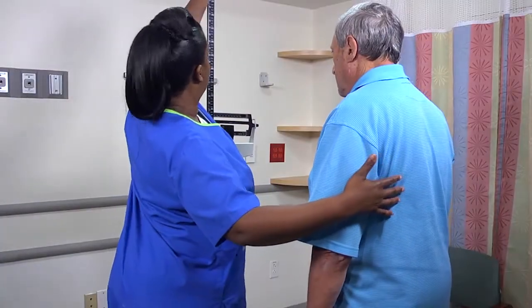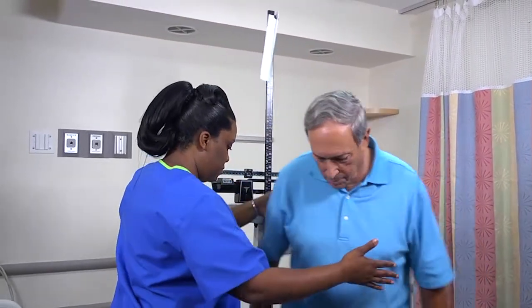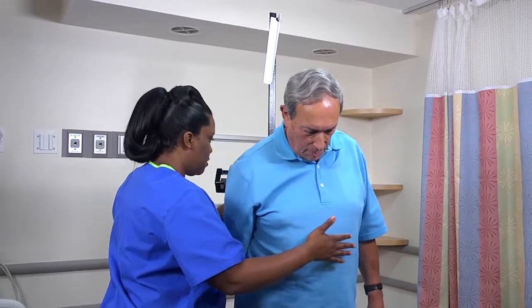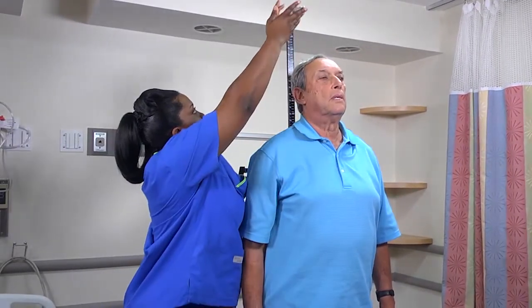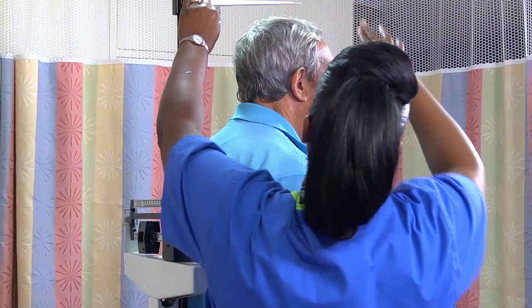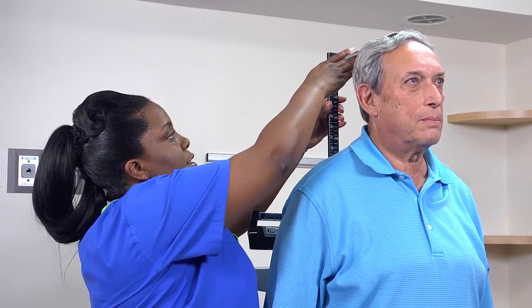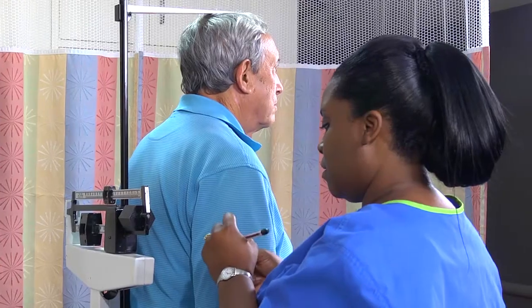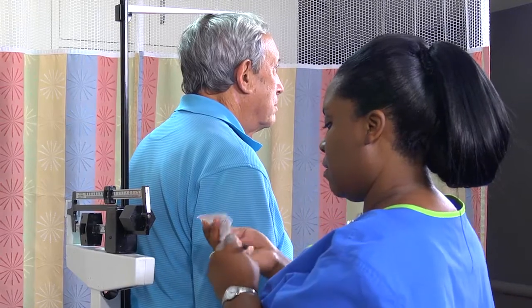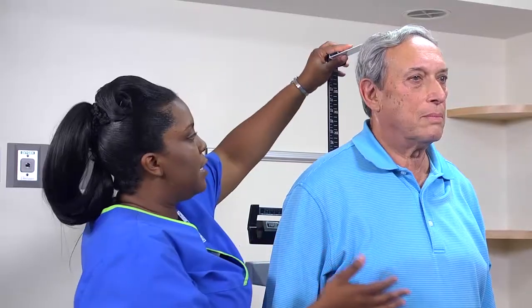Now you're ready to measure the patient's height. Ask him to stand erect and distribute his body weight evenly on his feet. His arms should hang freely at his sides with his palms facing his thighs. Ask the patient to look straight ahead. Take a deep breath and hold the position as you bring the horizontal bar down firmly to the top of his head. Measure his height to the nearest tenth of a centimeter or eighth of an inch. To read the measurement accurately, your eyes must be level with the bar.